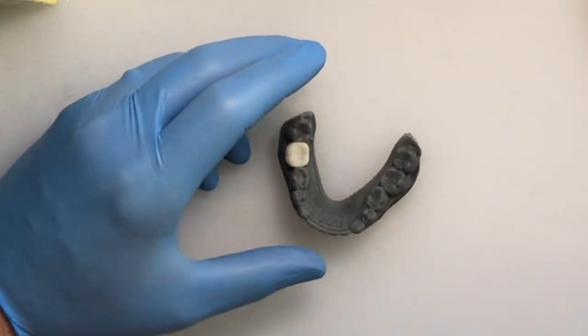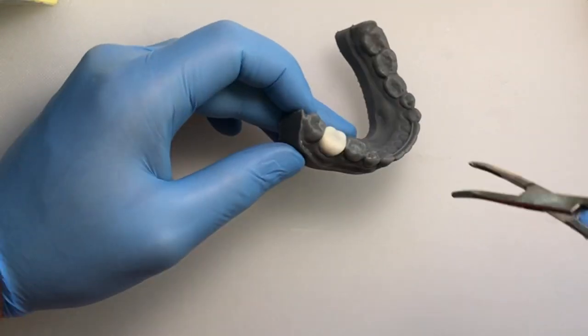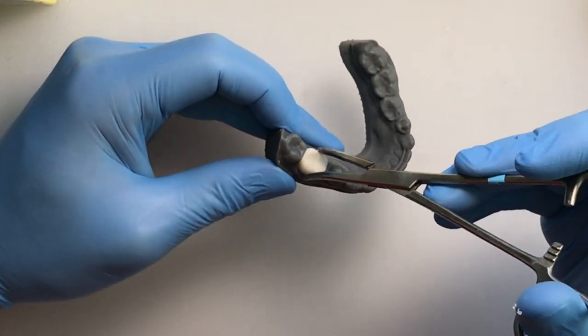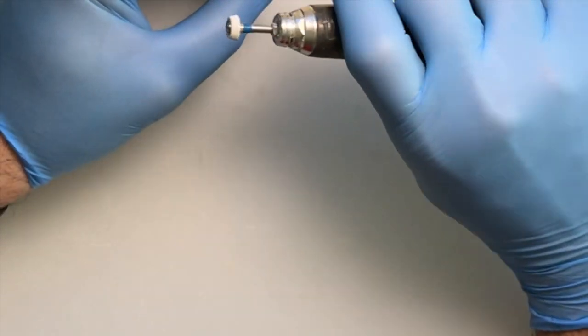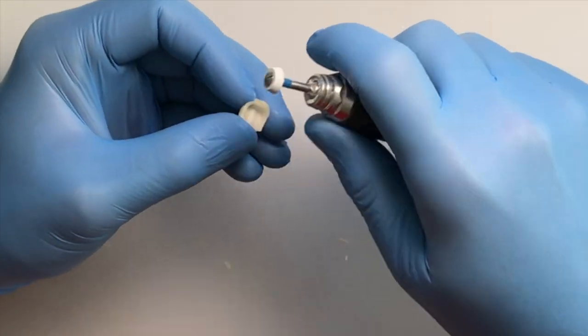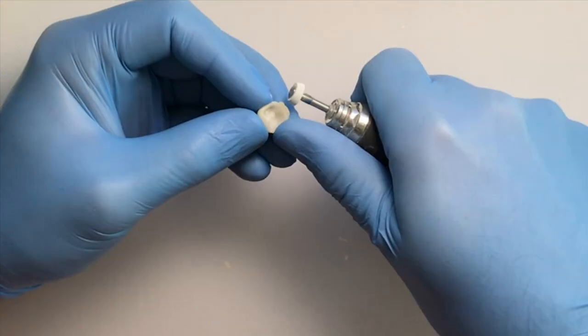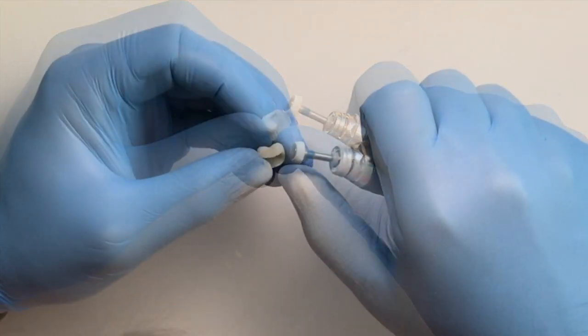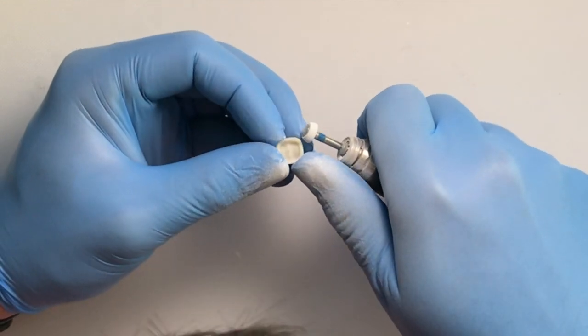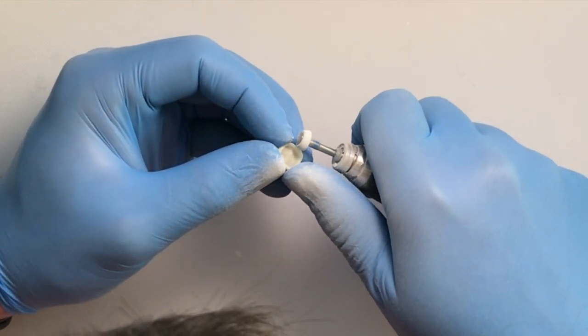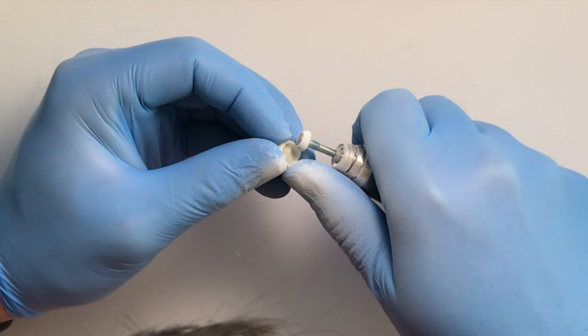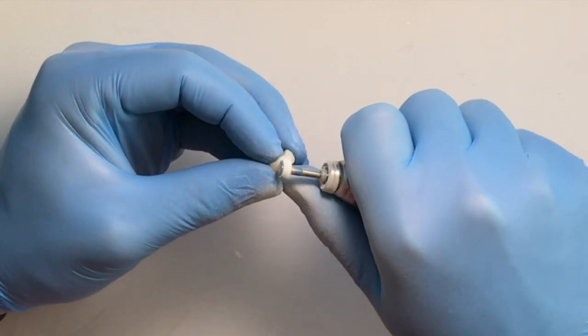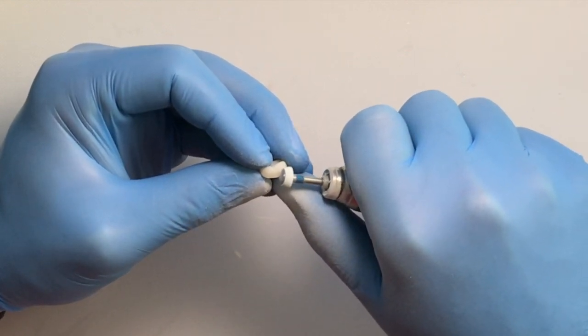Once the provisional is cured, we'll remove it carefully from the model. You can see here, using some hemostats, we'll then return to the polishing wheel or the aluminosilicate wheel and polish it so it's a nice and smooth transition from the facial, lingual, and proximal surfaces, ensuring there's no flash.